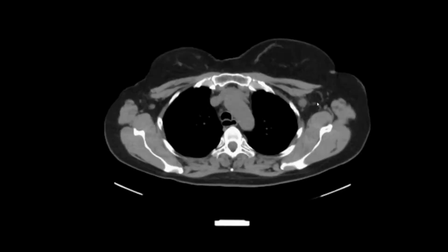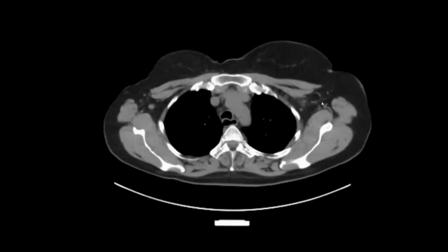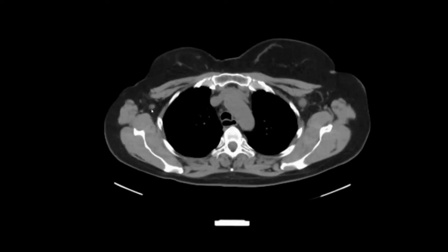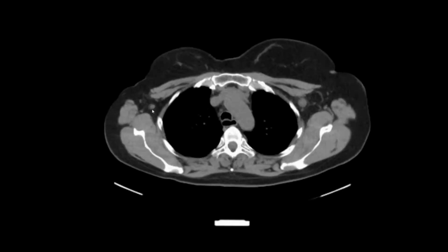As you can see here, there are also these other lymph nodes, which, while they do appear large, maintain their normal fatty hilum and reniform shape, so those are less likely suspicious for malignancy. If you look here on the right, this is another good point: this lymph node actually was PET positive for malignancy. And so size doesn't necessarily matter.